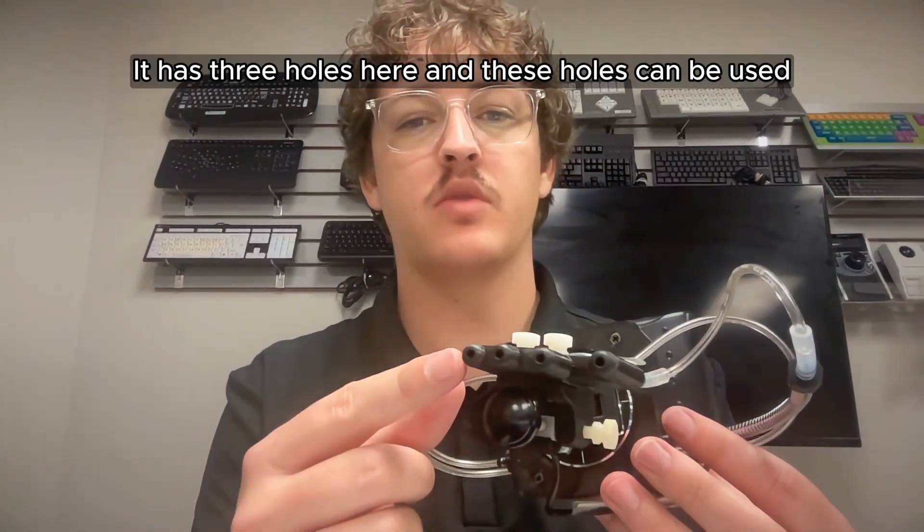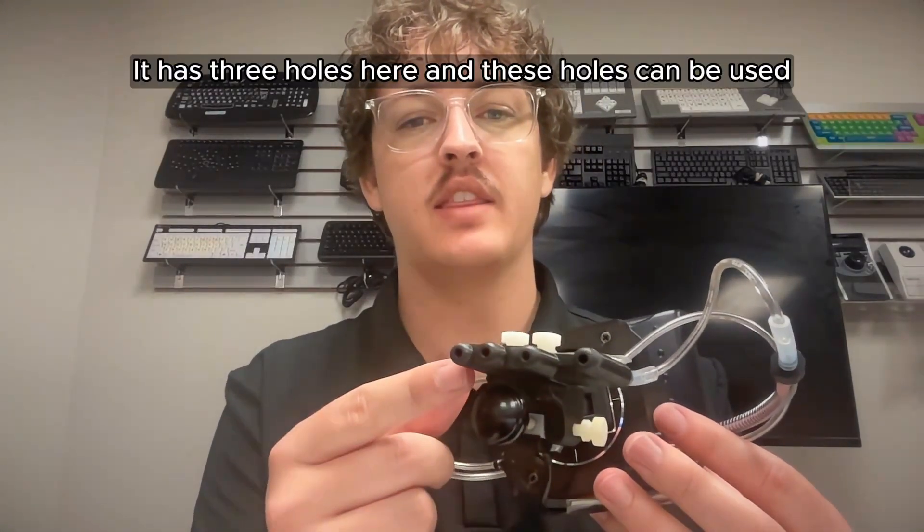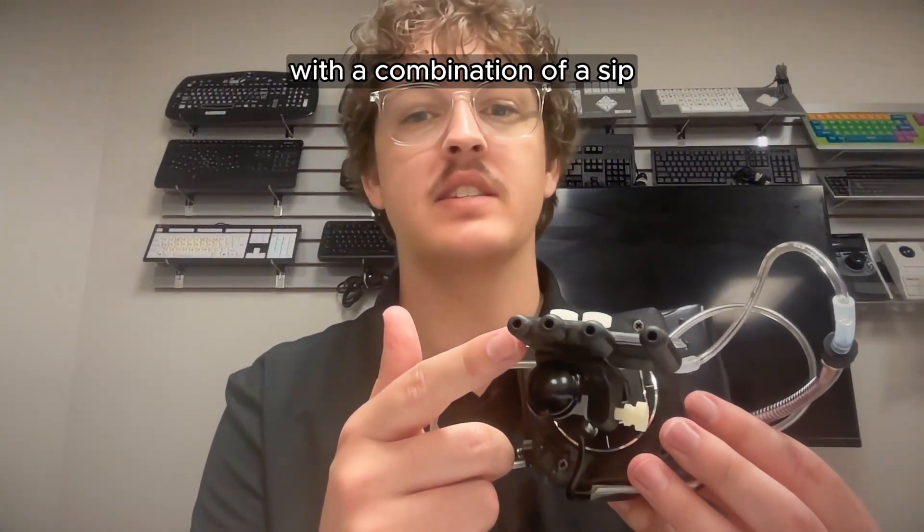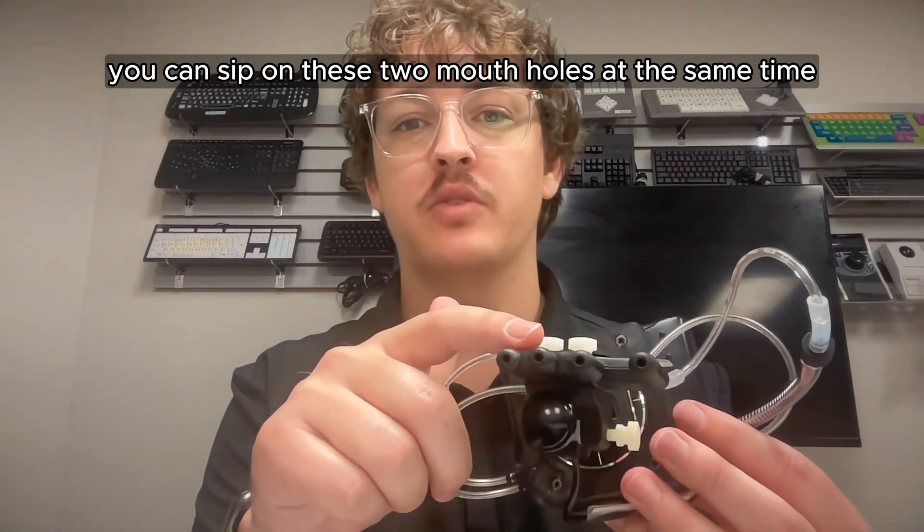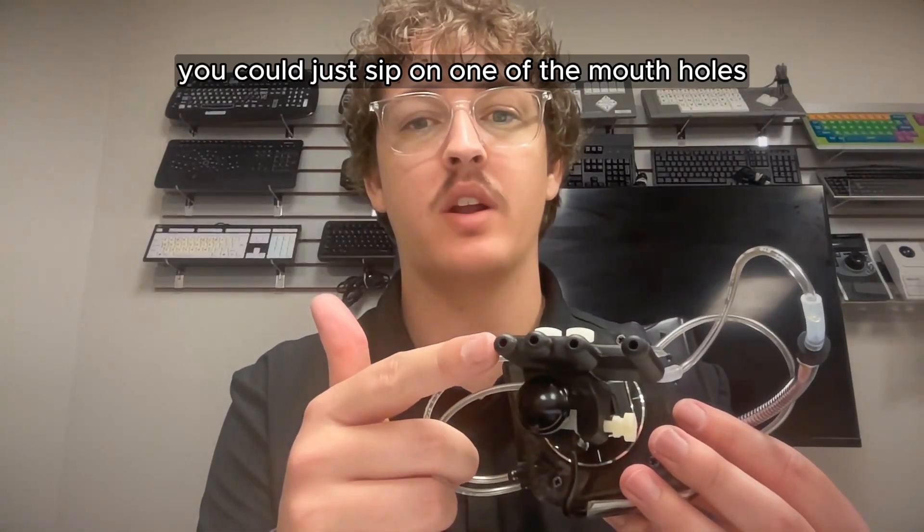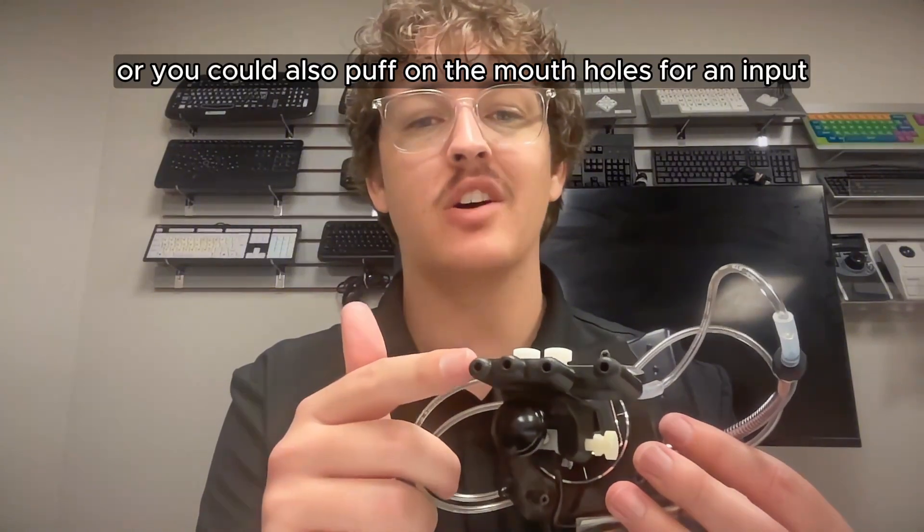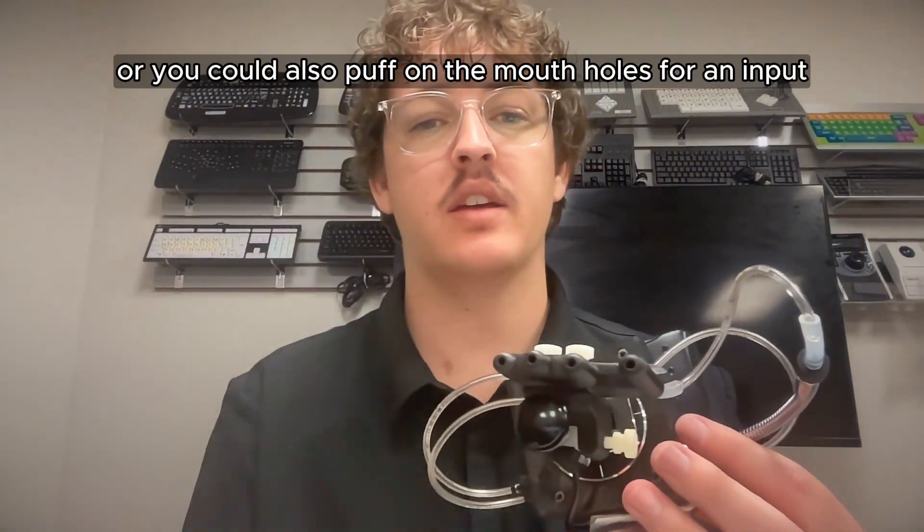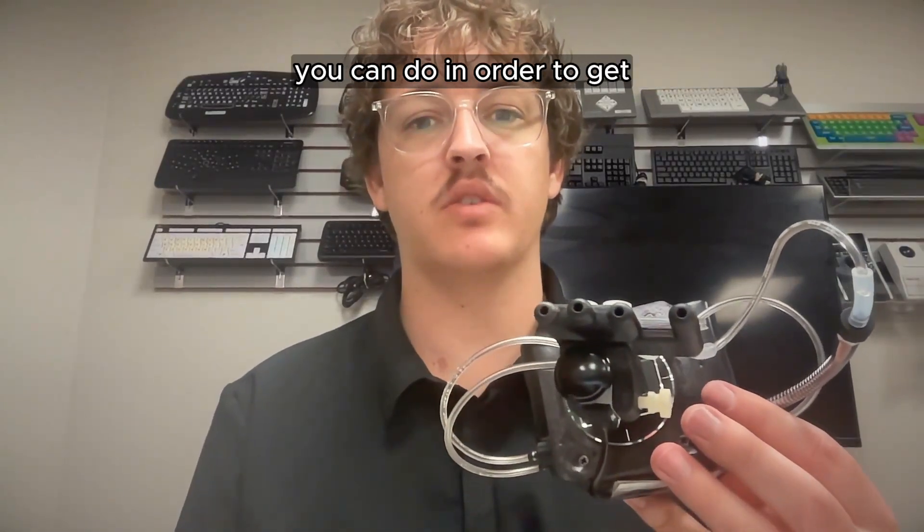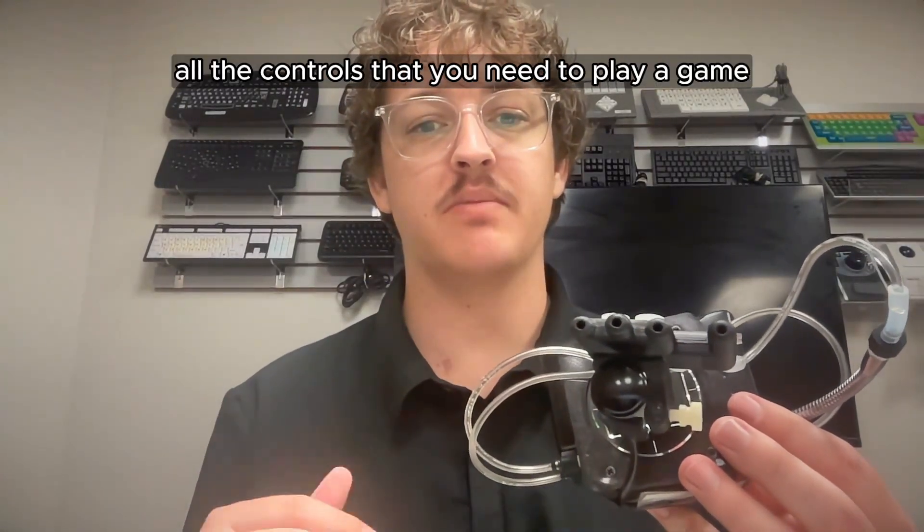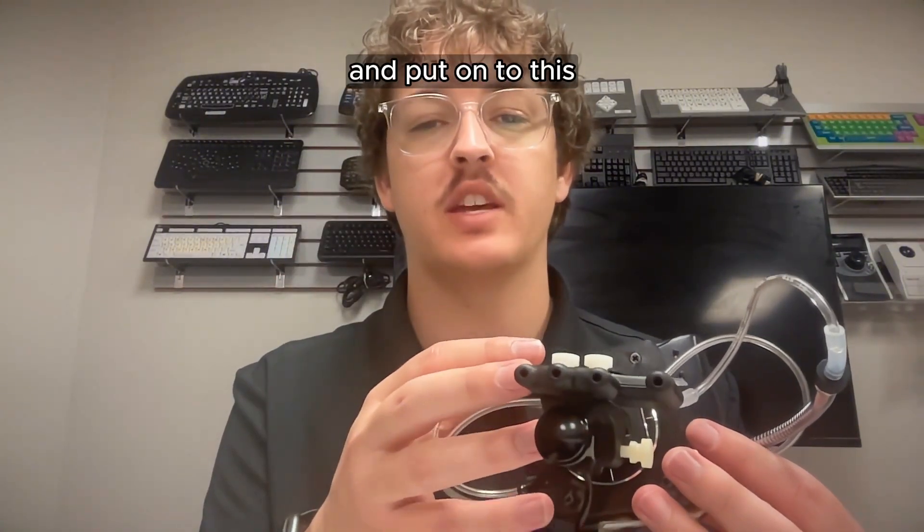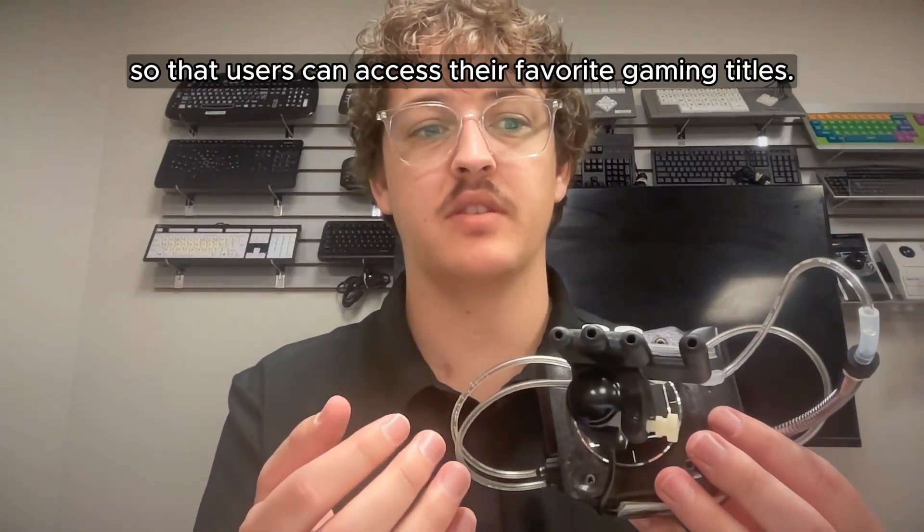It has three holes here. And these holes can be used with a combination of a sip, a puff. So you can sip on these two mouth holes at the same time for an input, you could just sip on one of the mouth holes for an input, or you could also puff on the mouth holes for an input. And there's a bunch of different combinations that you can do in order to get all the controls that you need to play a game from a standard controller and put onto this so that users can access their favorite gaming titles.